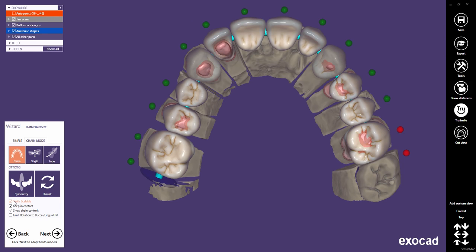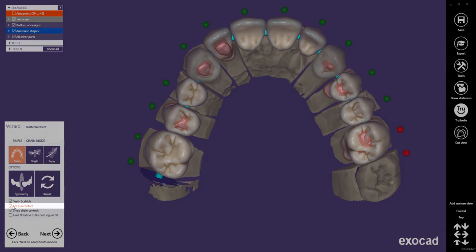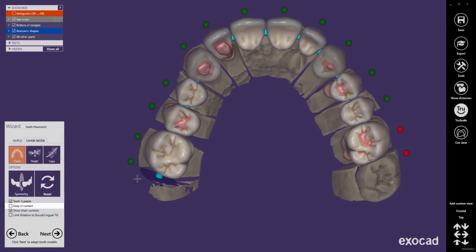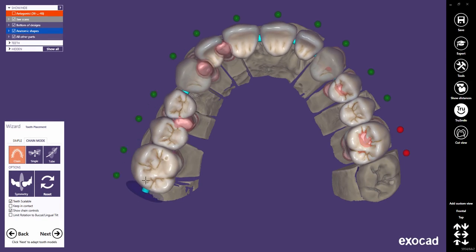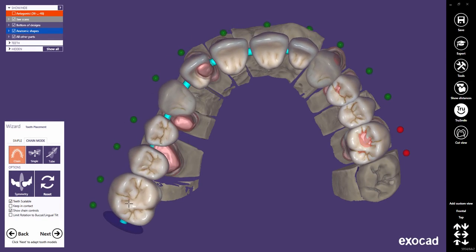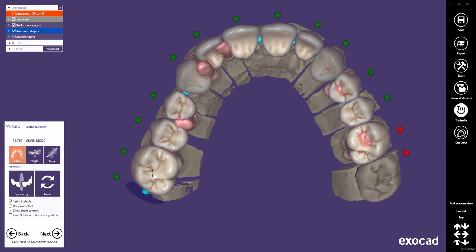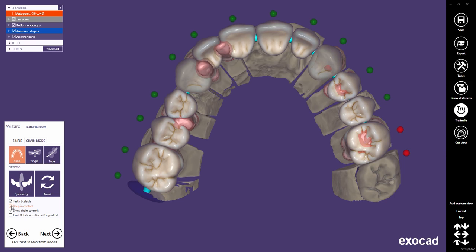By default, the teeth always stay in contact while doing transformations. If switched off, you can create gaps between the teeth when stretching the chain. Activating keep contact again will re-establish the contacts.